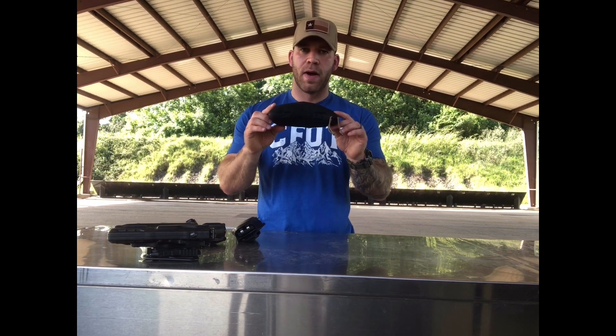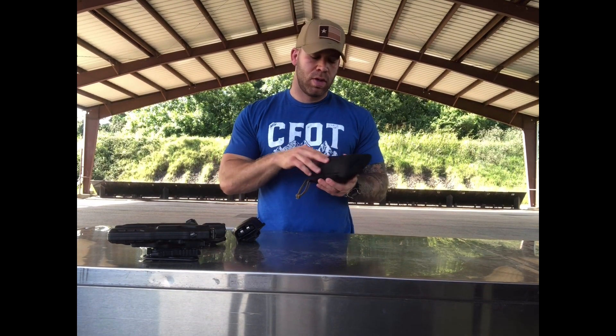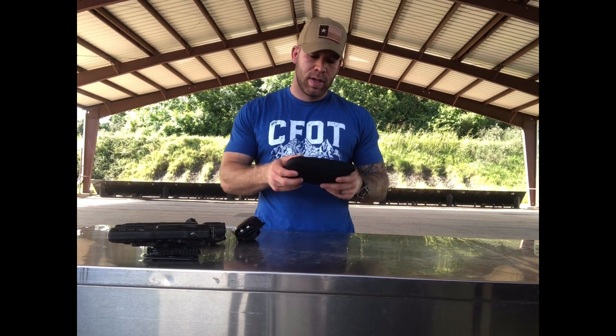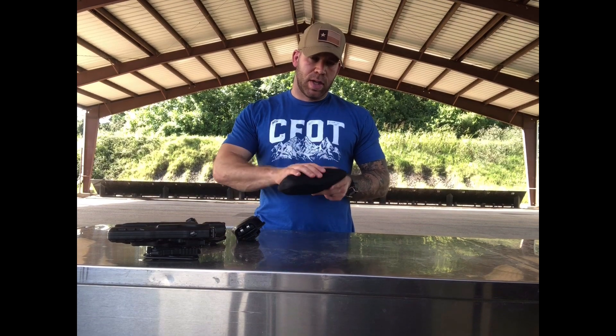He designed it to be very low profile so it can fit easily into a purse or a backpack. It's got laser cut MOLLE on the back so you can throw it on your duty belt or on a backpack with MOLLE on it. The low profile helps because we're probably going to end up having to wear it on our lower back — we want to keep it centerline so we can reach it with both hands. Having something big and fat would be very uncomfortable when driving around all day.